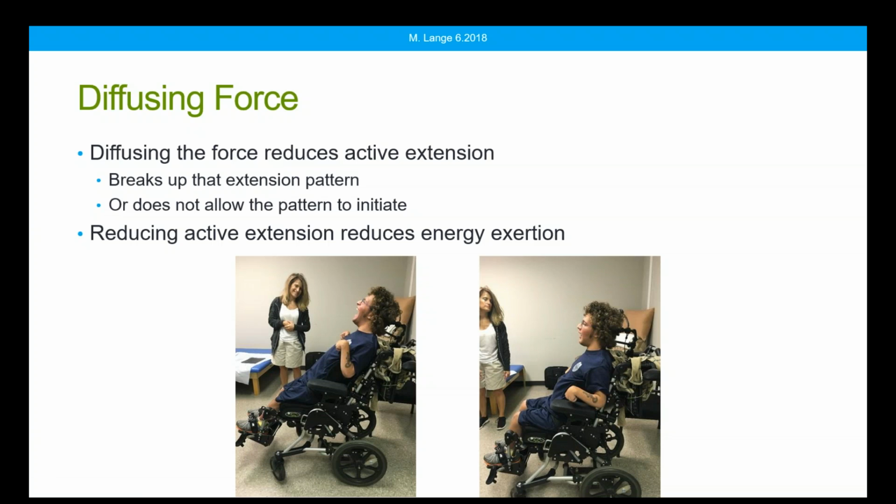and he has not lost the position of his pelvis. Without dynamic seating, he would extend like this within his seating system, and then when he finally stopped extending, he would end up losing his posture, where with dynamic seating, these extension periods of time were much more limited. He wasn't able to push with the same amount of force because the leverage was taken away from him and he could return to that position.